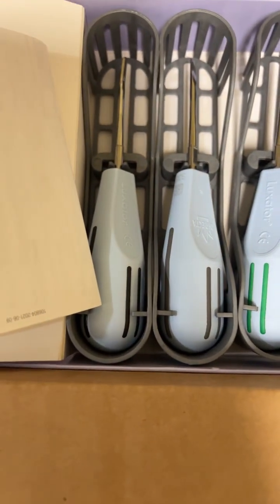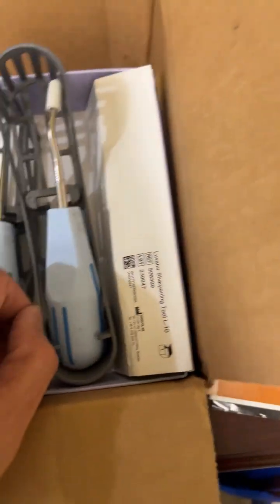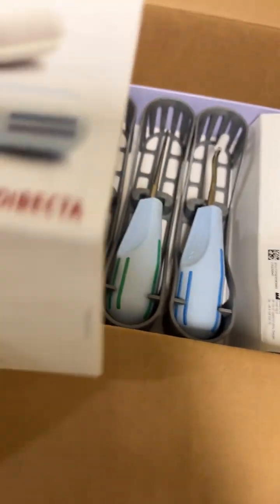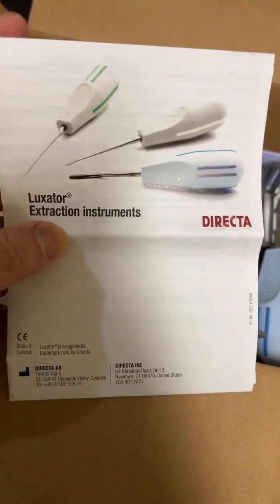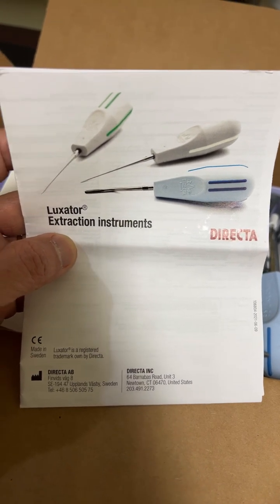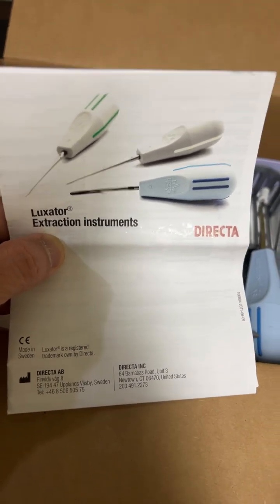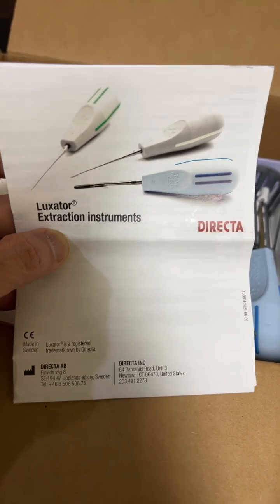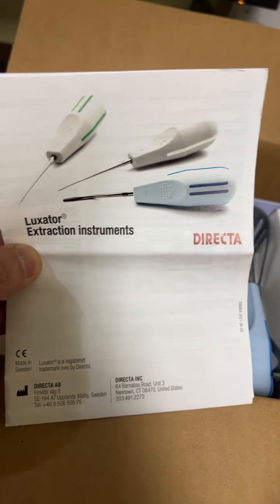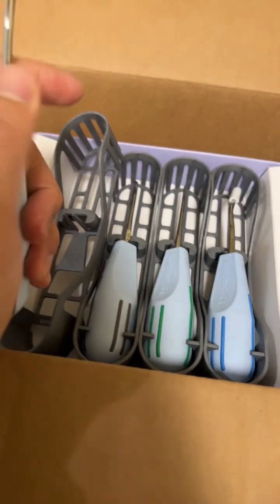Hey guys, welcome back to my YouTube channel. I just opened a box of the luxator that I ordered from this company called Directa. This is additional information regarding the last time I showed you how to extract atraumatically. This is a really cool instrument I've been using for a few years from one of the places where I work, and I finally purchased this one.